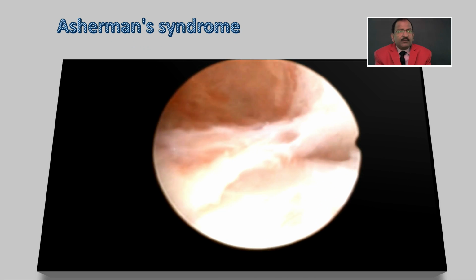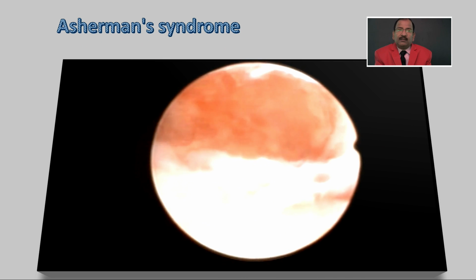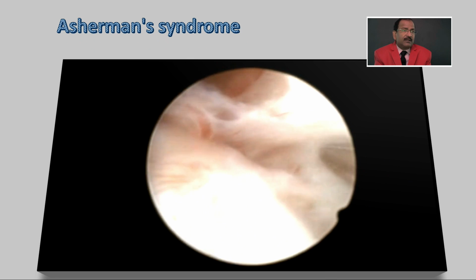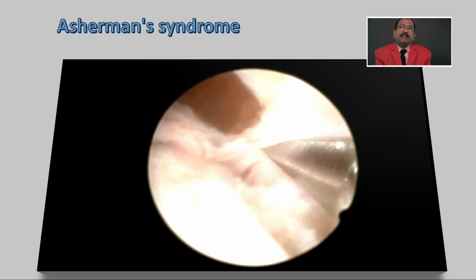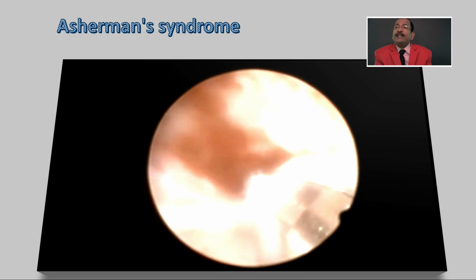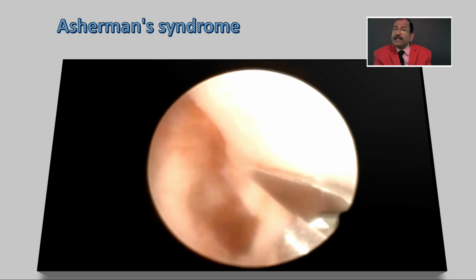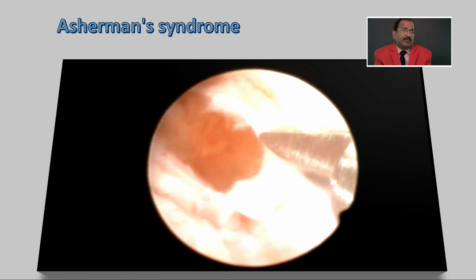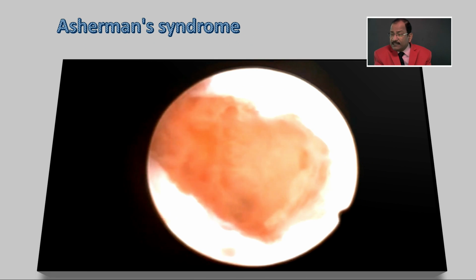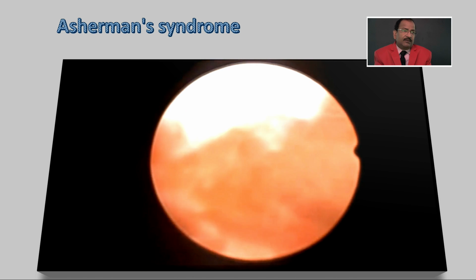So under laparoscopic guidance, sometimes you can see trans-illumination. You will touch the light to the fundus and you can see trans-illumination also. So that's why it's good. And cold scissors, current should be avoided, because current will cause more readhesions because of collateral damage. And after cutting this, you should put an IUCD, to prevent further adhesion.